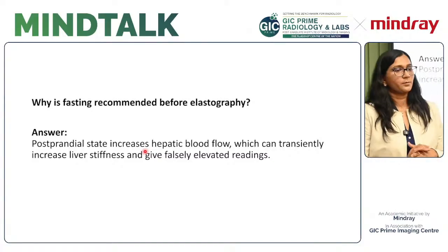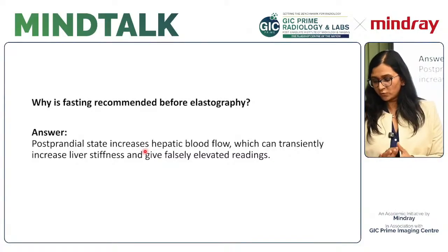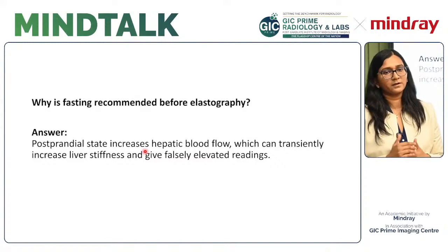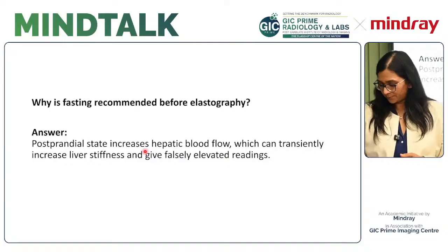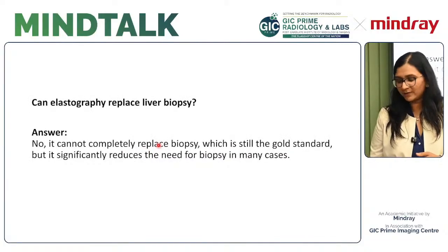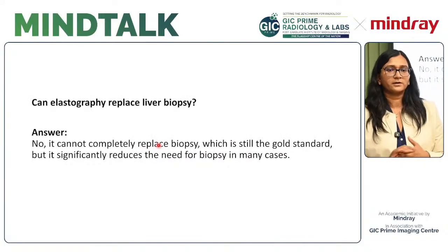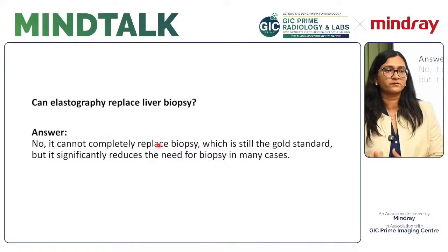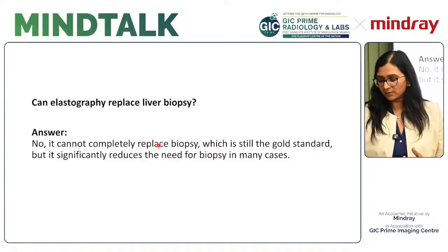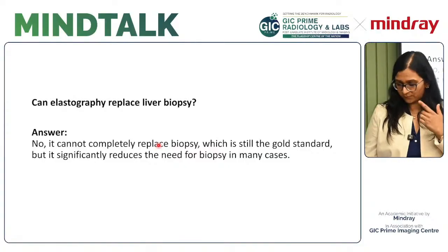Why is fasting recommended before elastography? Because the postprandial state increases the hepatic blood flow and the kPa value may come higher than normal. Can elastography replace liver biopsy? No, it cannot completely replace liver biopsy because liver biopsy is the gold standard, but it can reduce the frequency and need for liver biopsy.